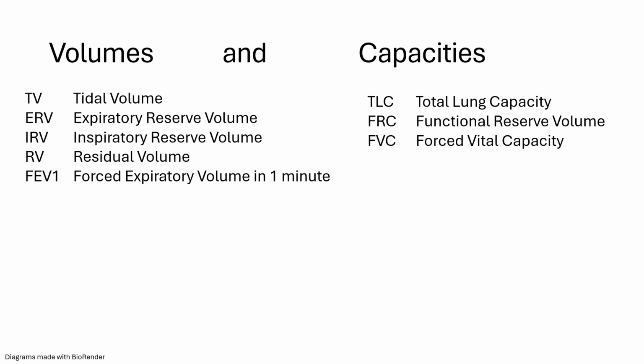Pulmonary function tests like spirometry are quick and easy to perform and also cheap. Most spirometers are simply a gauge and it measures the volume of air that you exhale. I can't really measure the volume that you inhale, just exhale. I can certainly have you blow up a balloon or a bellows, and I can measure the air that collects in it.